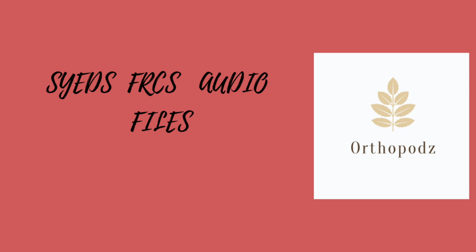PET scan, positron emission tomography. This is for tumor diagnosis. A fluorodeoxyglucose, FDG, is injected, transported, and accumulates in the area of high metabolic activity, emits positrons, positive charge, that react with nearby electron to result in photons.